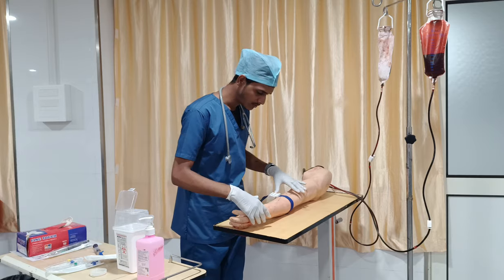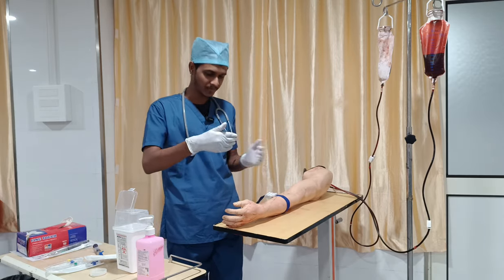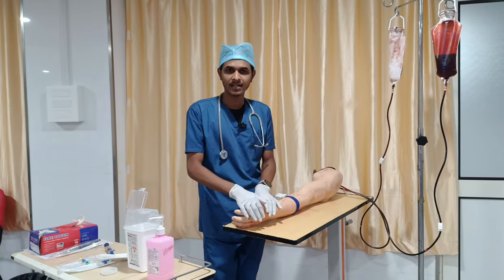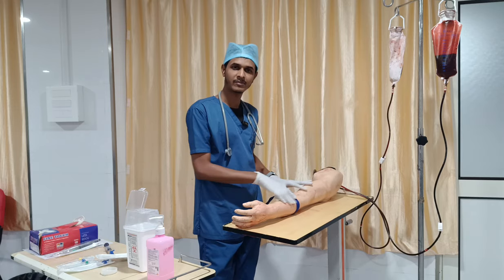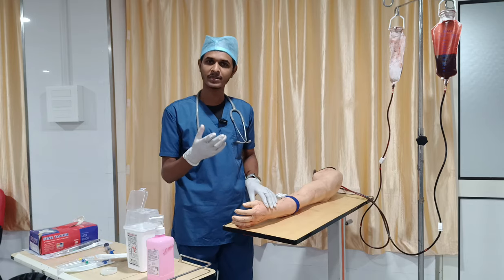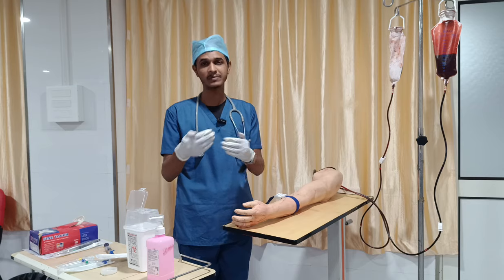Before getting into the cannulation, always try to go from distal to proximal. If you are selecting the upper limb, you can go from your metacarpal to your brachial region. Why? If you first prick the brachial and phlebitis or hematoma formation happens, that will affect or interrupt the whole circulation.